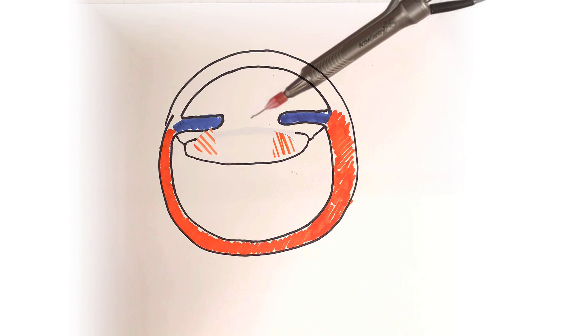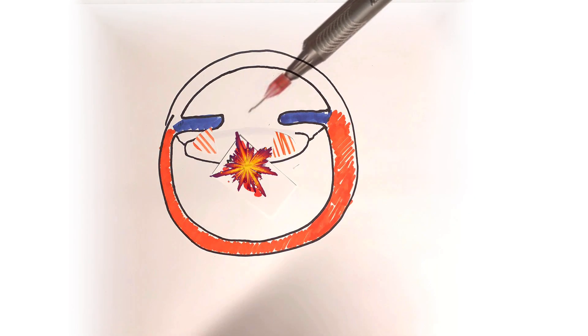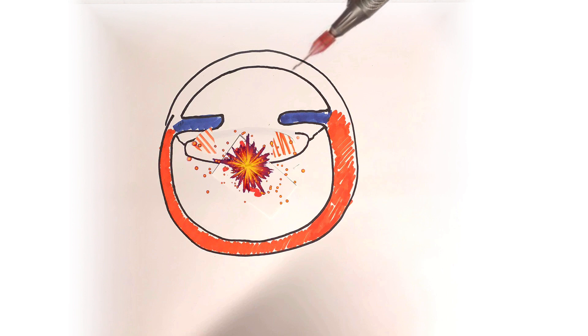However, if this capsule is weak or if it breaks during the cataract surgery, then there's no longer any barrier to separate the anterior and posterior segments of the eye. Here's the problem.